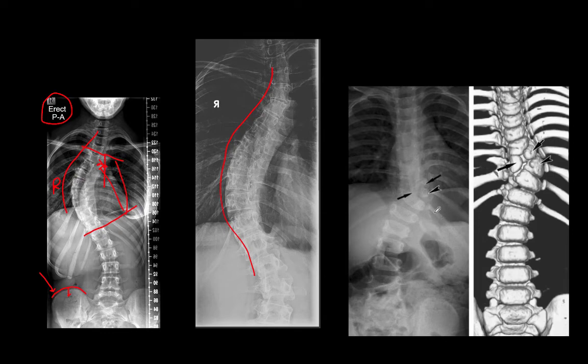In the next image, kind of the third image off to the right here, you'll notice that this patient has more of an angular deformity. You'll notice that it's a left convex curvature. And you'll also notice that they have some interesting rib stuff going on here too. Notice how much space is occurring between these two ribs, which is really the area of the anomaly zone here. And you can tell there's kind of a cluster of osseous abnormality here.